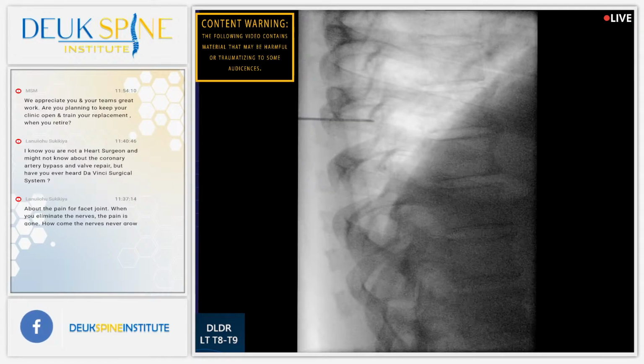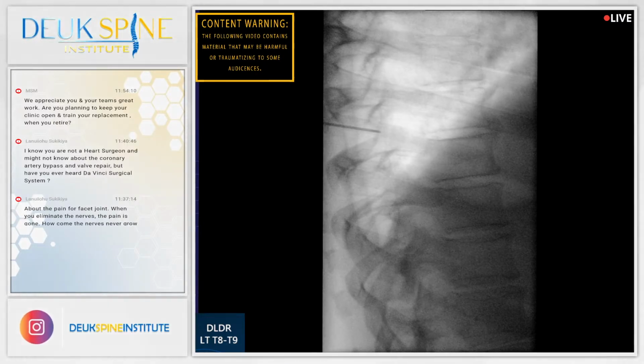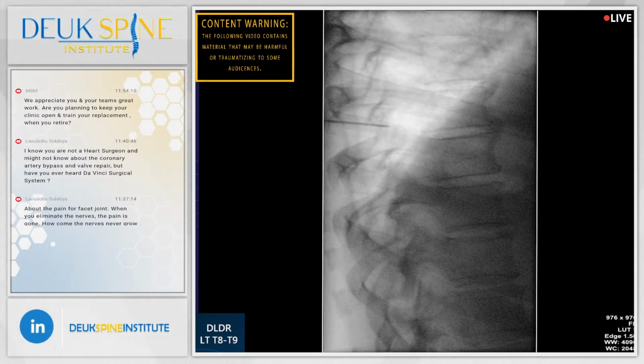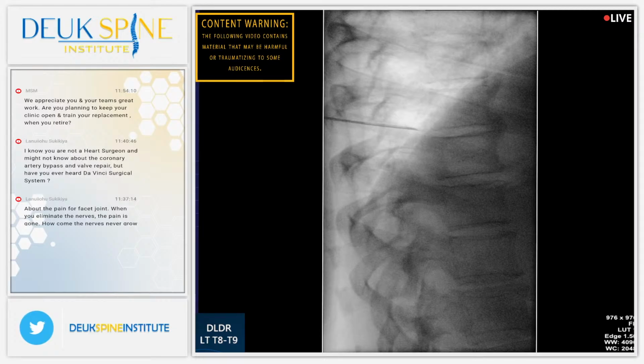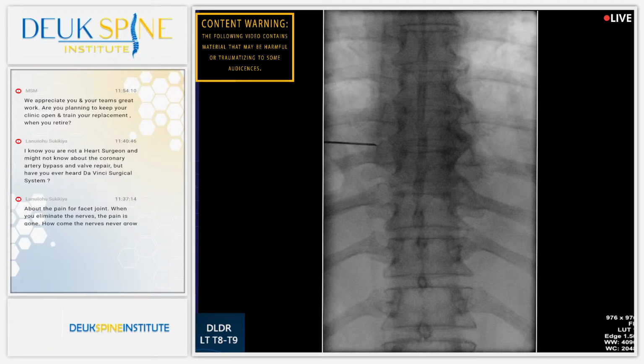Shot. AP. No. We're still too far lateral again.